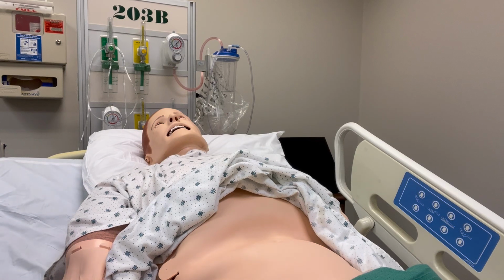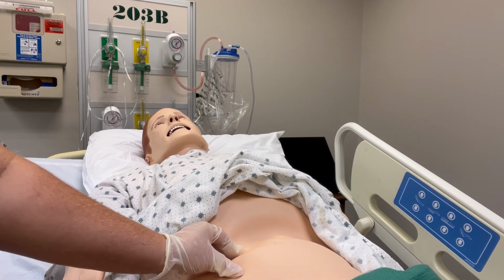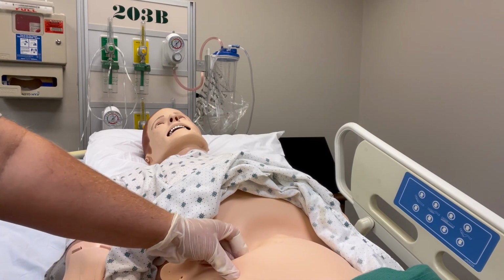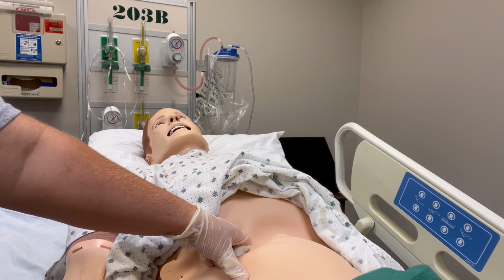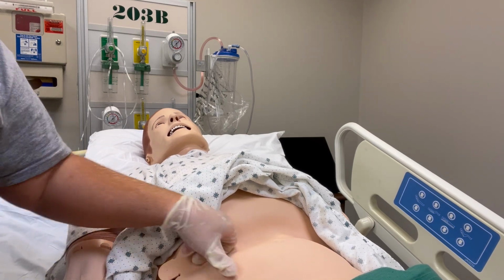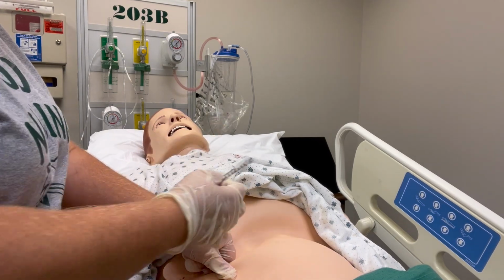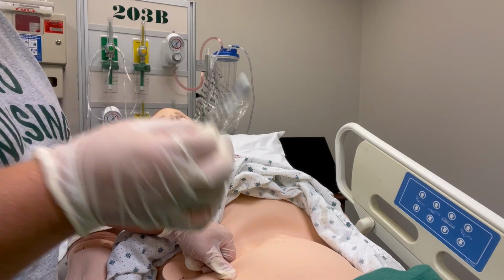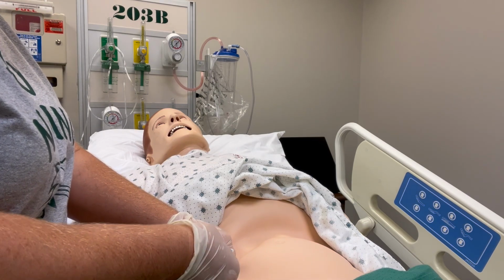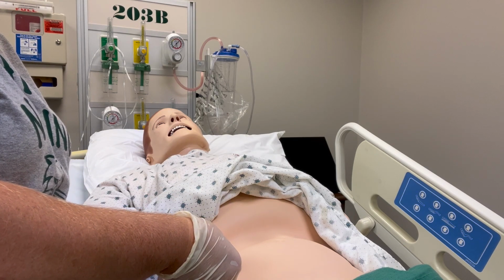All right, so again, with my non-dominant hand, about 1 inch from the belly button, I am going to pinch some fatty tissue there. And if your patient is obese and the pinch of adipose tissue is 2 inches or more, then we might need the longer needle. So for Mr. Smith, his pinch is less than 1 inch. So I'm going to insert this at a 45-degree angle. So I cleaned there. I've got my bevel up and I'm pinching less than 1 inch and I'm injecting at about a 45-degree angle. And then I'm going to just inject slowly.